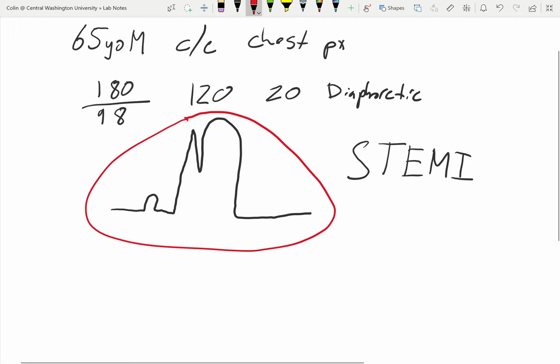And my guess is if you were to pause this video right now and go to YouTube and type in 12 lead EKG MI or heart attack, you would instantly be able to recognize which ones look like the ones circled in red. Does it look like an old school fire helmet? Does it look like a tombstone? Or better yet, can you recognize that there is ST elevation right here? And if you can, then good. Then you can recognize if the person's having a heart attack.